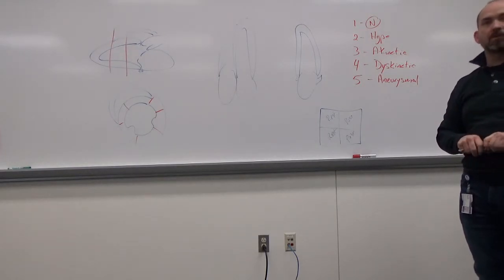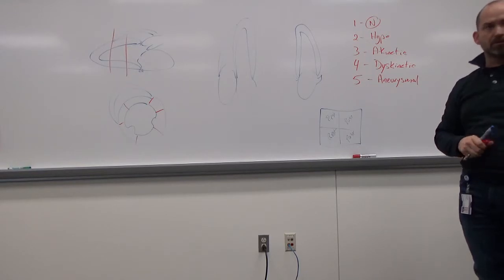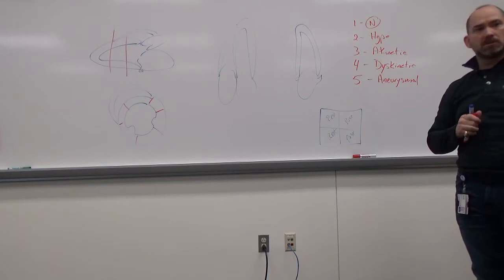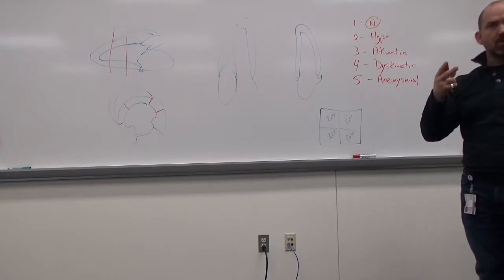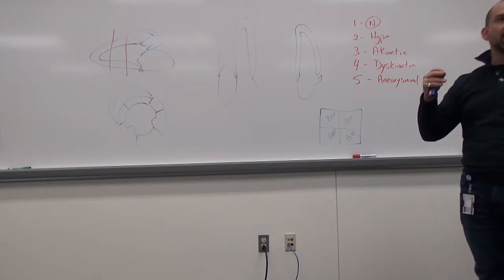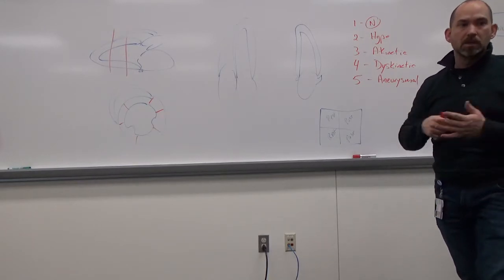When do you stop a test? When the patient can't go further. What else? Signs and symptoms. Target heart rate. Good. So those are all things, and some of that could be, you have your absolute contraindications like we talked about in EKG, like if somebody's got an unstable angina, for example, you're not going to do a stress test on them.